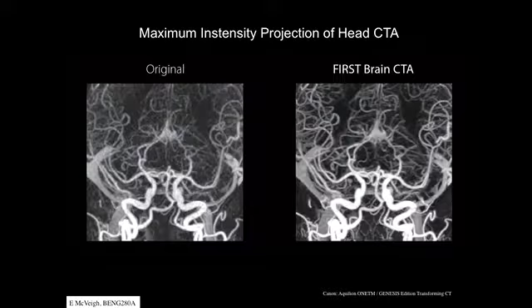And so all of the arguments that Dr. Liu has been making about making systems with broad modulation transfer function, i.e. high resolution, apply here. You would like a lot of spatial frequencies transmitted through the system so that you can resolve small objects. In this case, we also are looking at three-dimensional data through the whole head, and what we've done here is we draw a line through the patient, right, so from their nose to the back of their head, and we ask the question, what is the maximum pixel along that line?